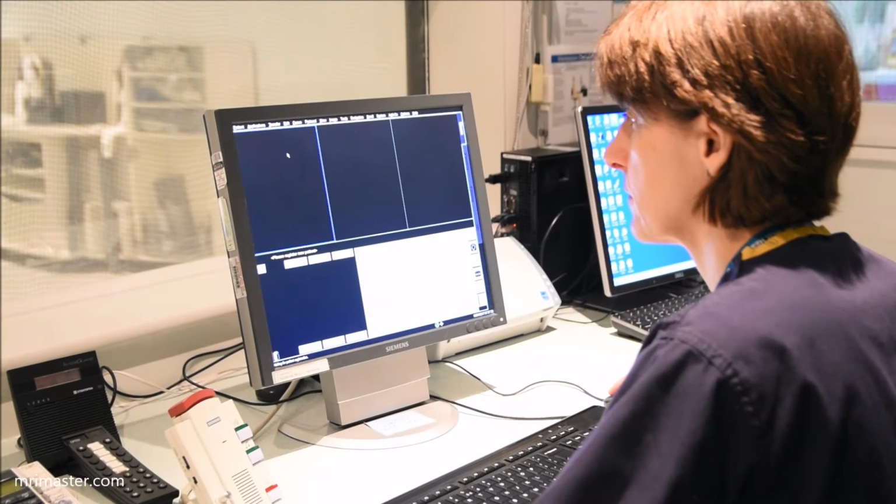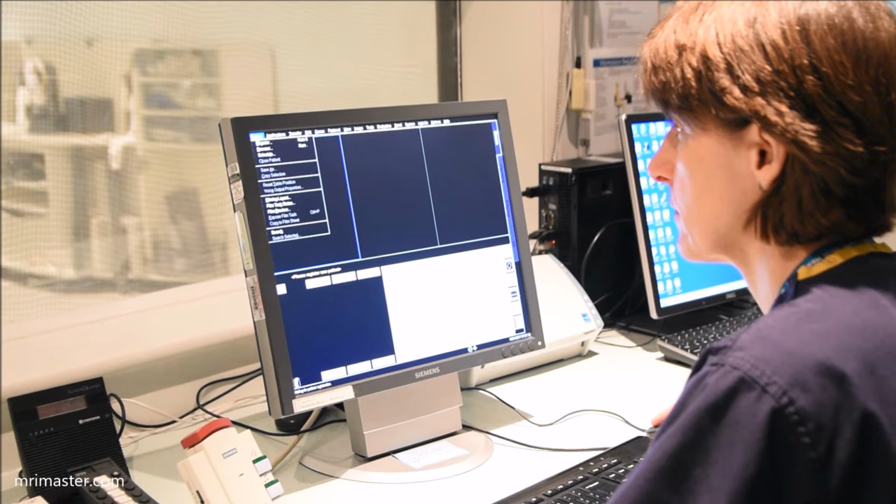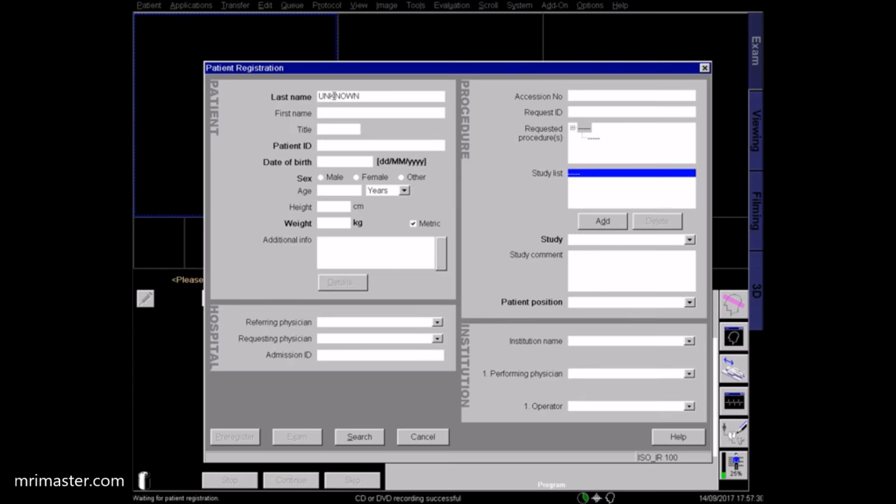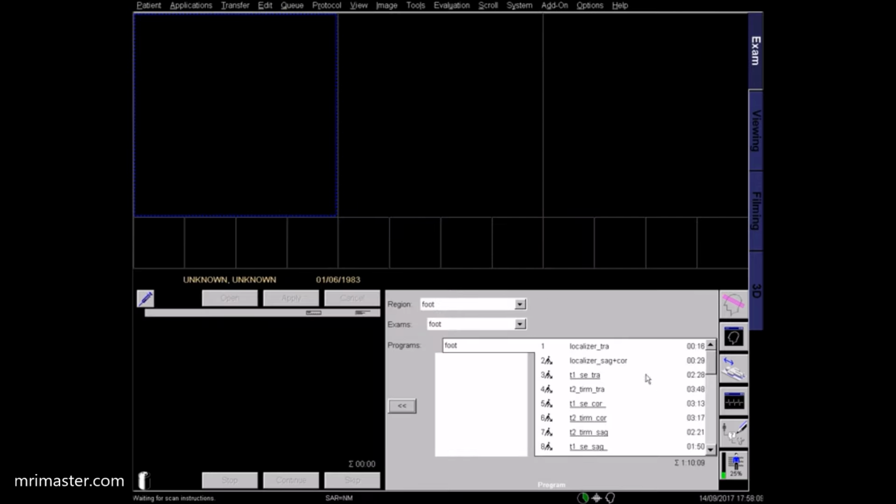Once back in the control room, select the correct patient details in the browser or type in the details manually if necessary. It's very important to get the patient details right. This includes entering the correct patient weight so that the SAR, or specific absorption rate, can be calculated accurately. Register the patient as lying feet first and supine. Select the correct protocol according to your hospital guidelines.